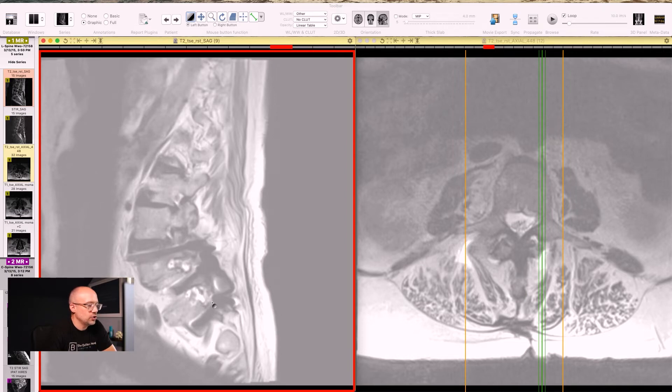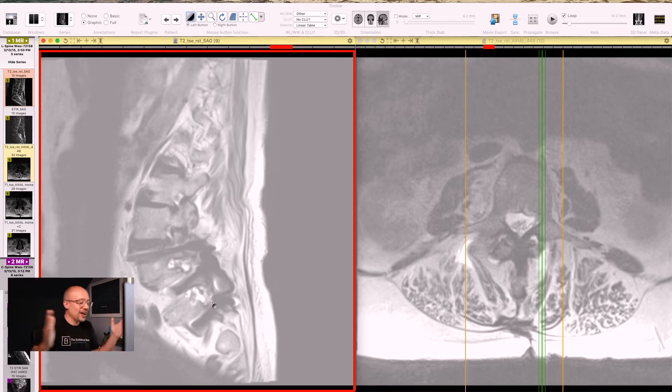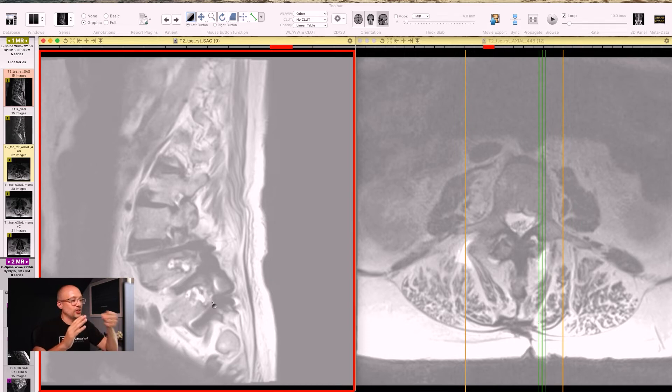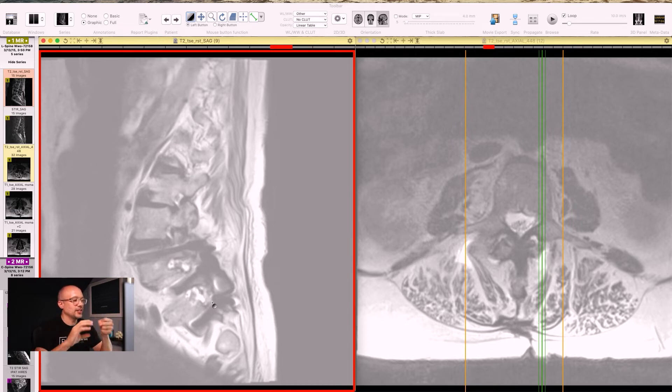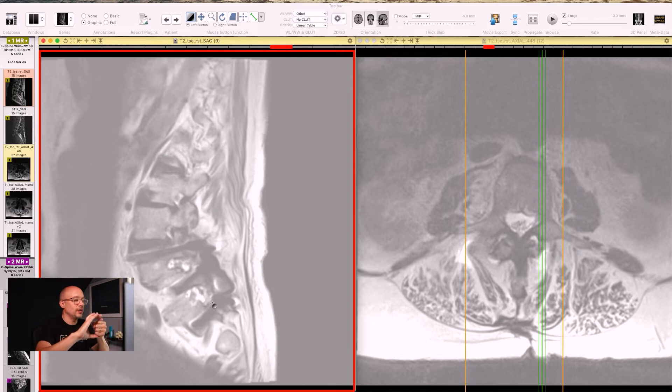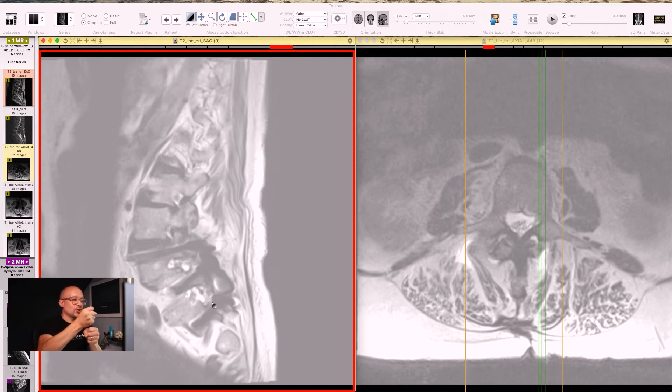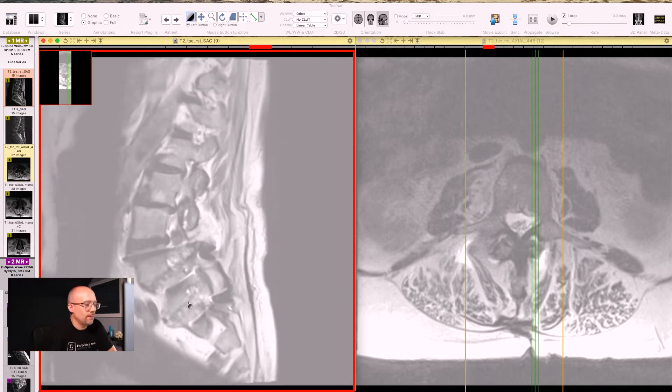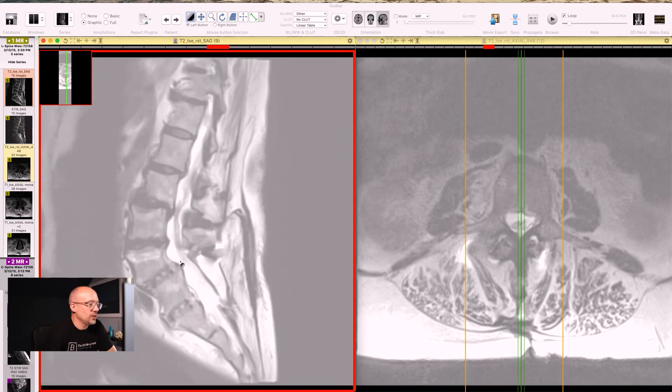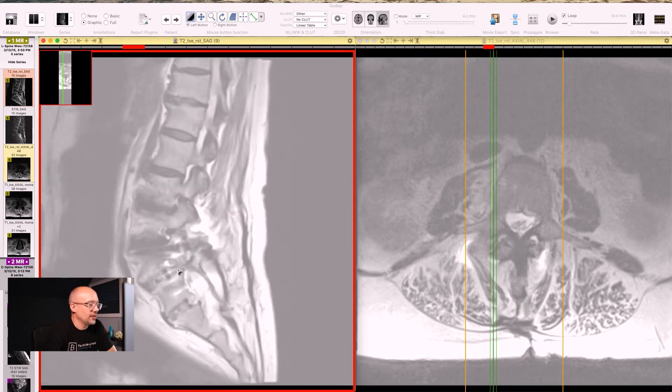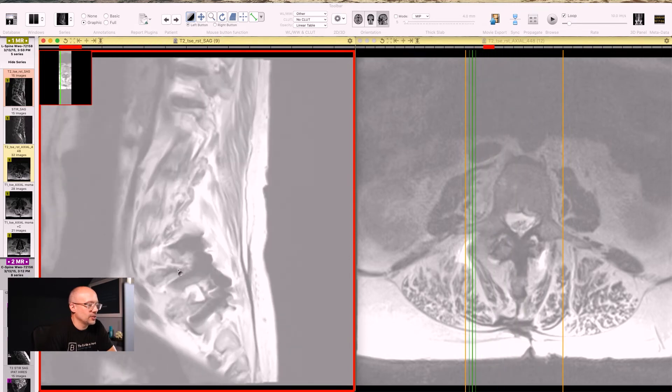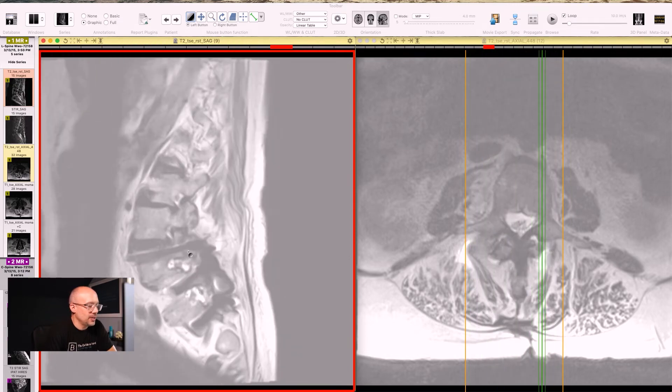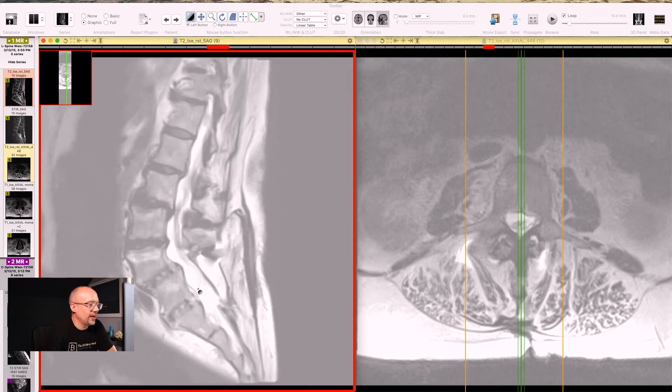When they do a fusion, ultimately you are put out, obviously, under anesthesia, you are cut open, and they remove as much of the disc as possible, and put a spacer in there, an implant or a spacer in where that disc used to be. Some of the disc remains, of course, but they take out as much of this as they can, put in a spacer, and that sort of stabilizes everything, and then they put the rods and screws in to help support that. So that's what we are seeing right there as we go to the sides, are a big mess of hardware at L4, L5, and S1.